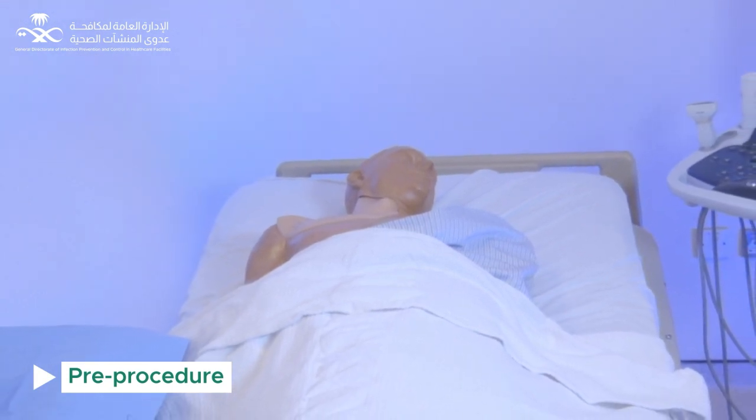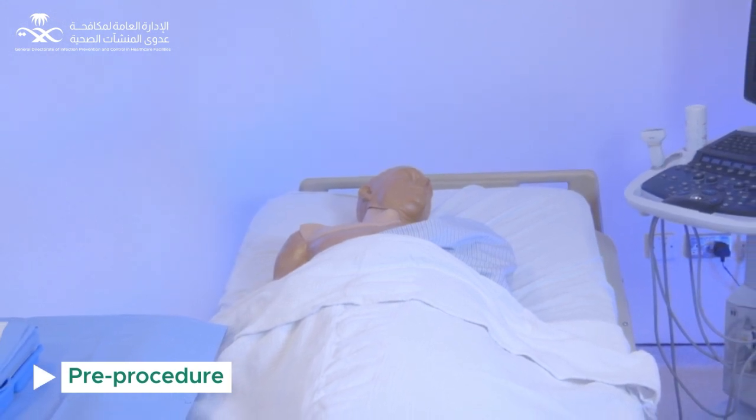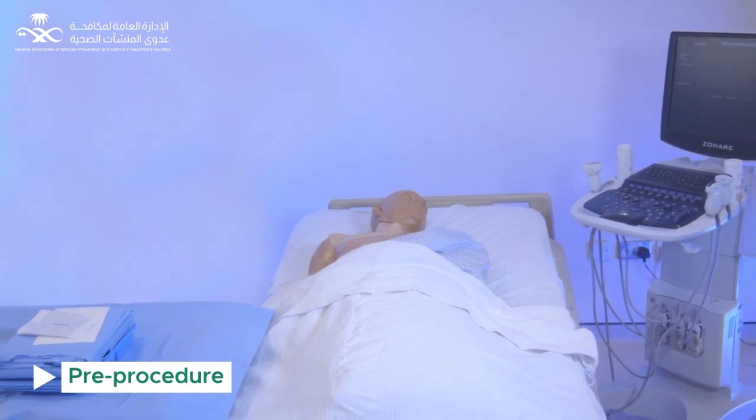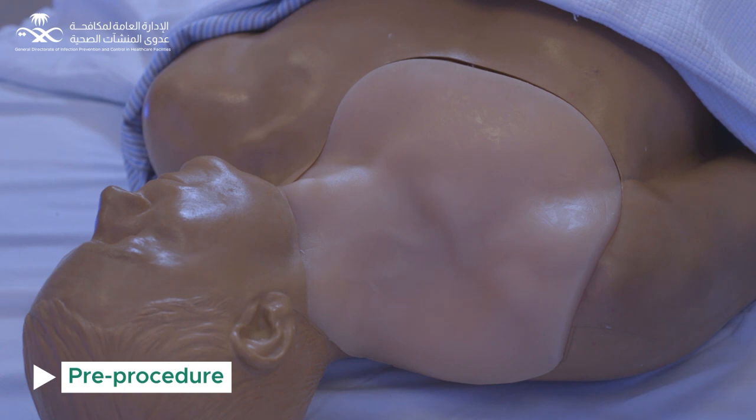Assess the proper access site for central line insertion and avoid the femoral site. The subclavian site is recommended for central line insertion. Place the patient in the required position to match the selected access. Inspect the site of insertion to rule out any local site infection.